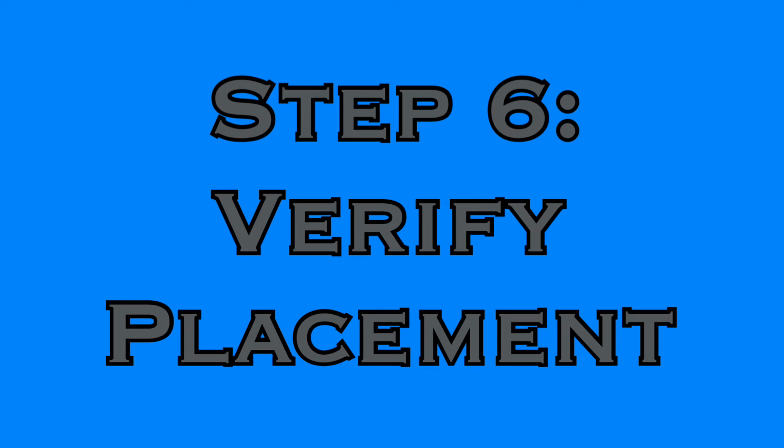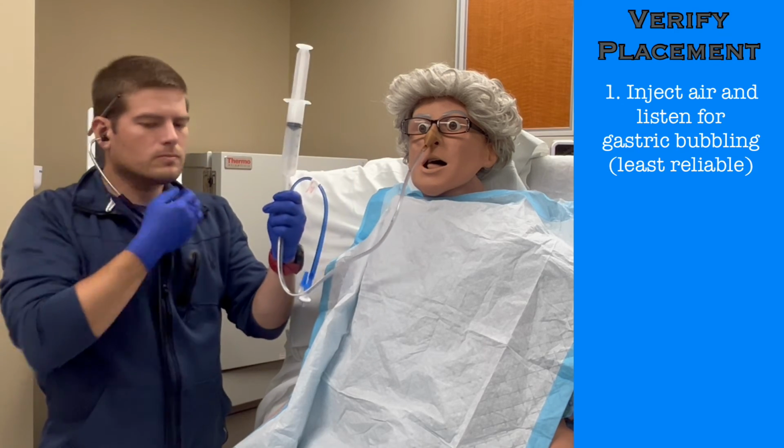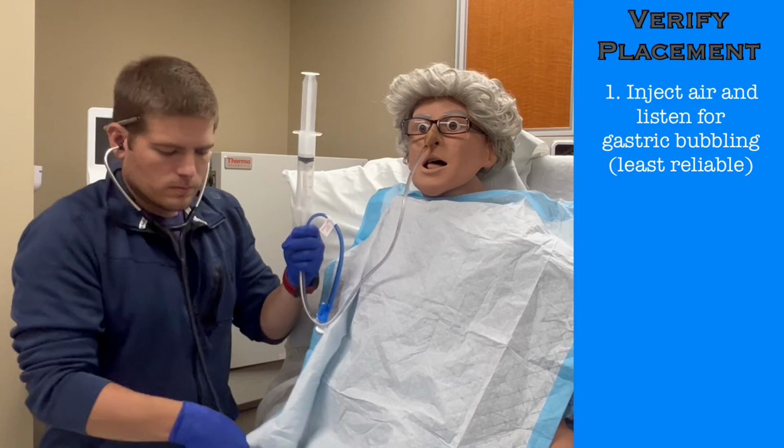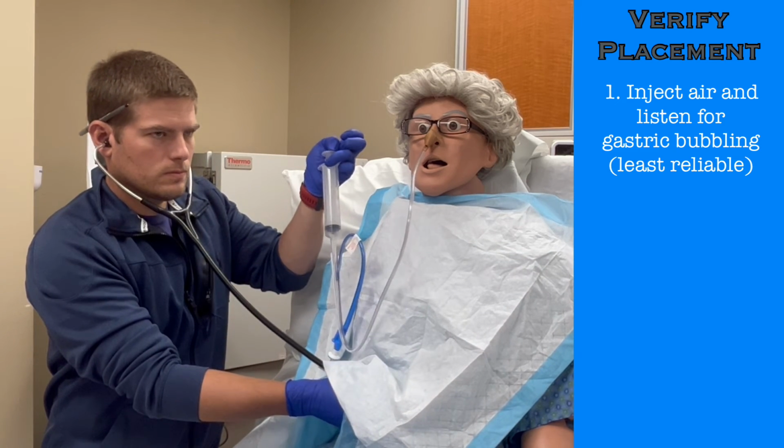Now you need to verify placement, and you can do this in a number of ways. The first, easiest, and ultimately least reliable is to inject air into the tube and listen with your stethoscope for bubbling. If you hear bubbling, it means you are likely in the stomach. If you don't, it means you're likely not in the stomach.